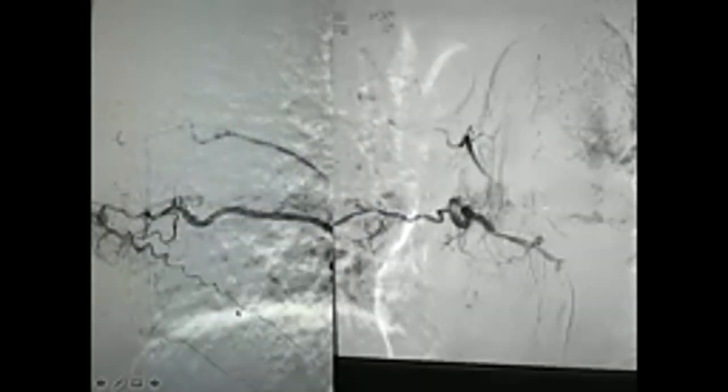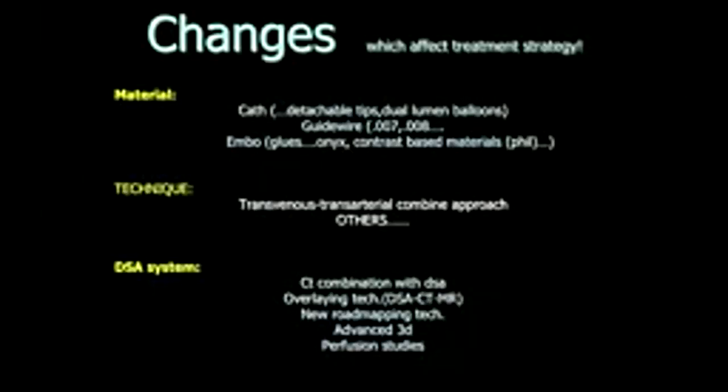And as you see, when you have a backflow around the microcatheter, when I reach that region, you need to stop. Because of what? After embo, the fistula is eradicated. Look at how easily contrast material goes up and down to the upper and lower intercostal arteries, and you can see another radiculomedullary artery arising from the upper one. You can easily occlude that. That's why you should have better visualization. During injection, you should stop your breathing. That change helps us a lot. This is the same case, 2-month follow-up.